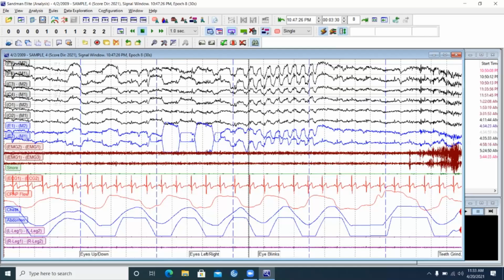When you don't offset the eyes, if they're pretty much even, you're going to see a limited deflection, especially like in here. So that's where it is important to do the correct placement for your eyes.